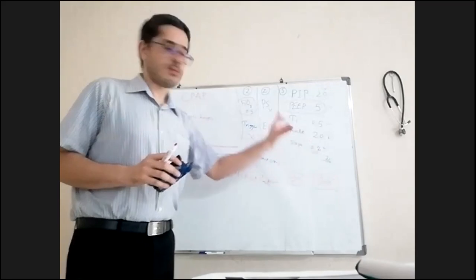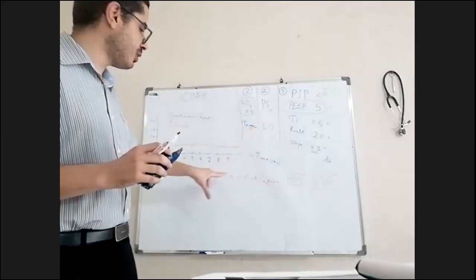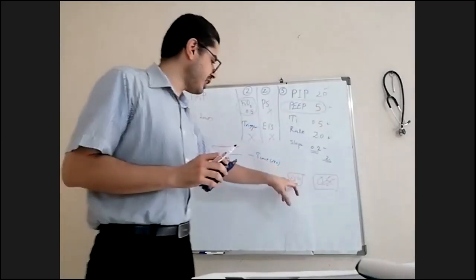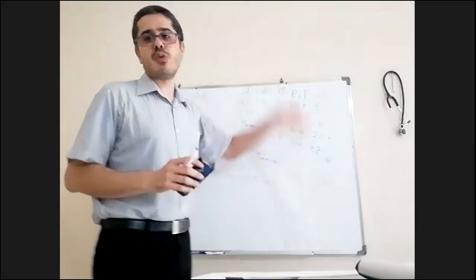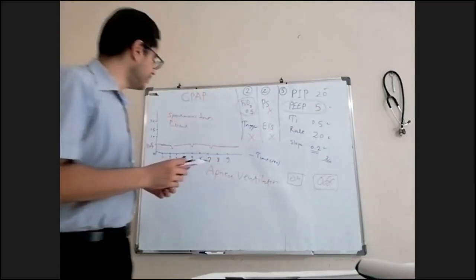It may alarm apnea if you set the alarm, yes, alarm apnea, but it will not give the patient any breaths. If you put the apnea ventilation on, then it will start giving the ventilation according to your setting.